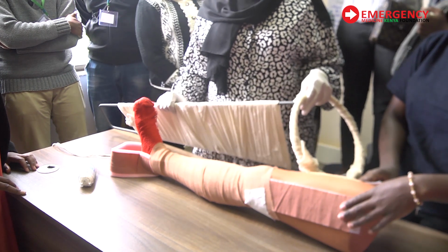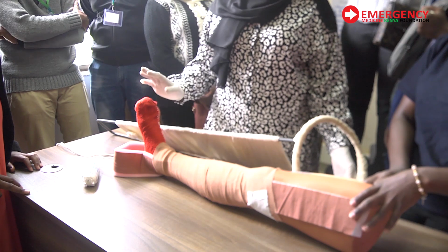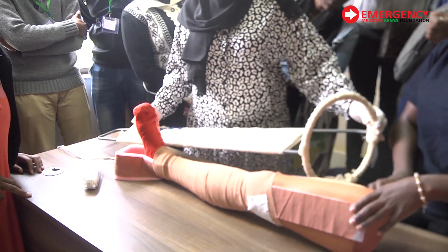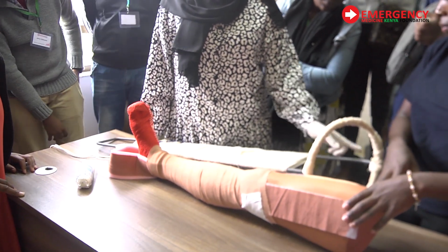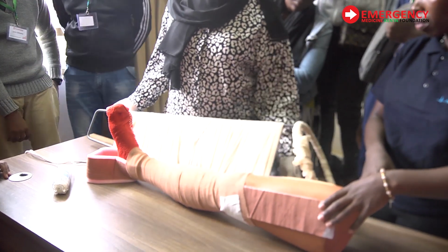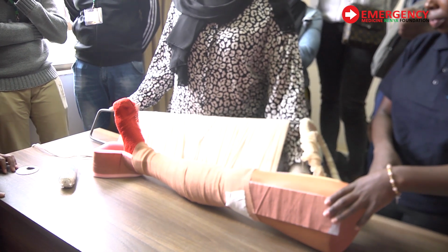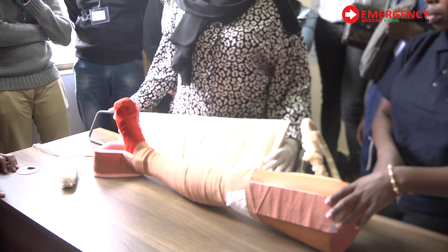So just make sure it's quite comfortable. You get it and you have inserted it in the right position. So this is the right leg, yeah? Yes, it's actually the right side. So you can actually insert this, okay? You see this pointed edge? It should be lying on this side. It should not be on this other side for the patient on the right leg, okay? Otherwise he's going to be sitting on this, making him more uncomfortable instead of pain-free, or causing more damage.